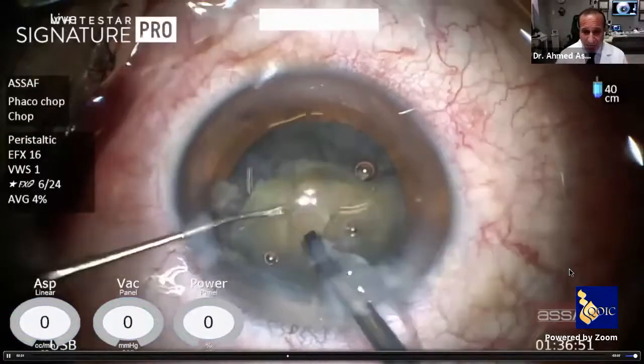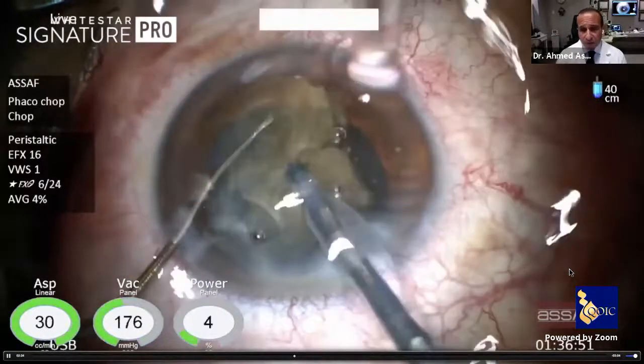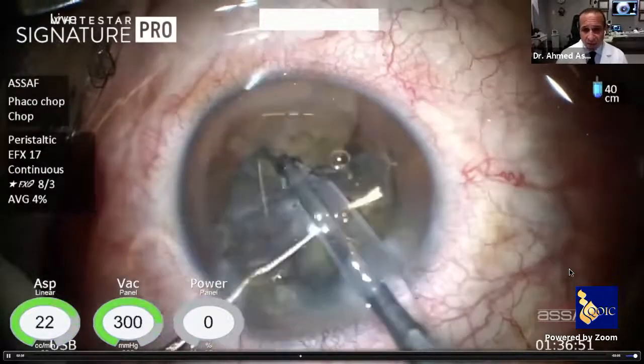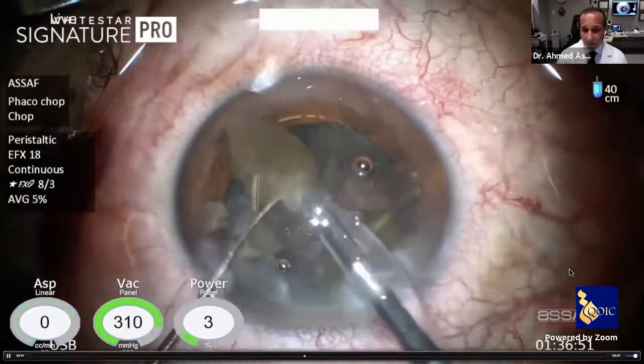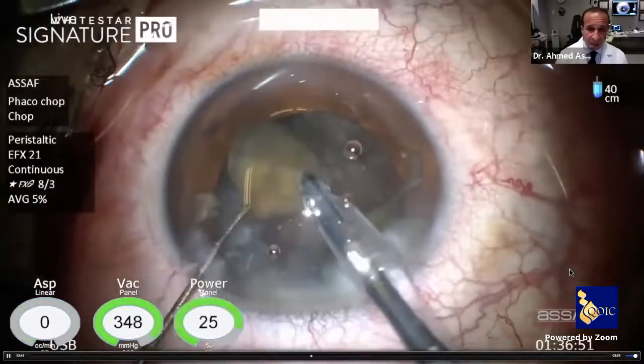And this adds to the stability and minimizes the fluctuation and trampoline effect of the anterior chamber in this eye, because there is no counter pressure from the posterior segment of the eye. This eye is fluid filled and not silicone filled.